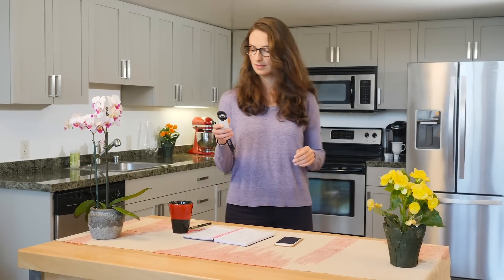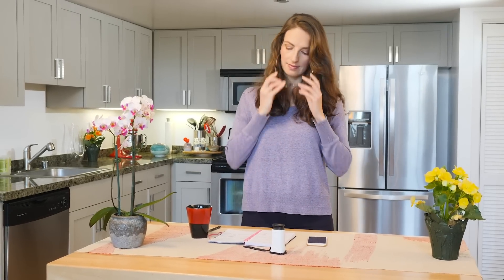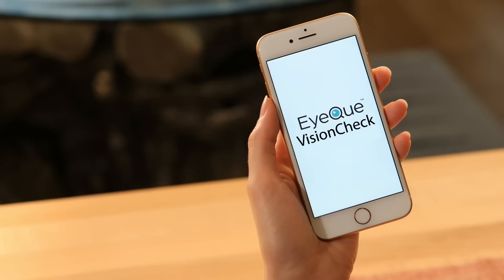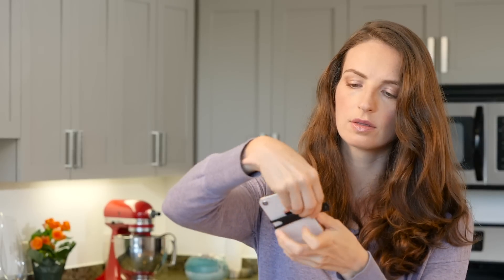To get started, pair your VisionCheck with your smartphone. Be sure to remove your glasses or contacts before testing. Then launch the VisionCheck mobile app. Next, simply attach it to your screen.